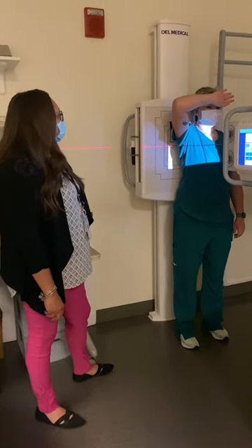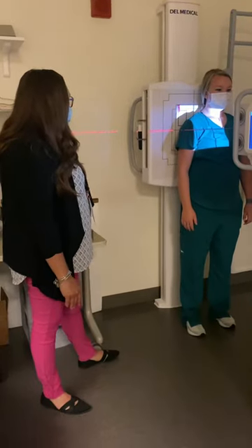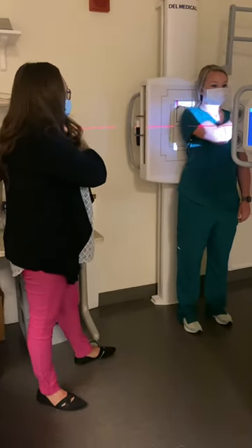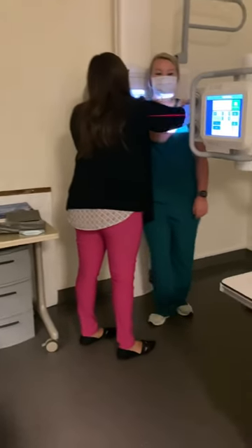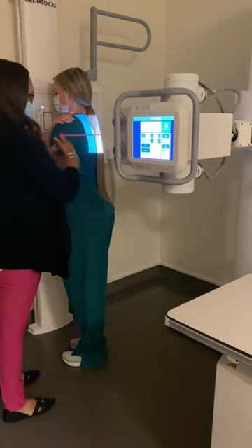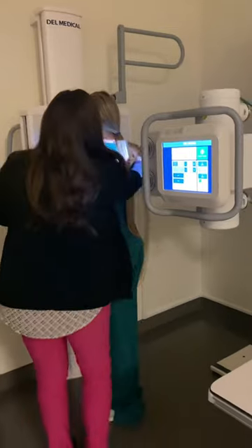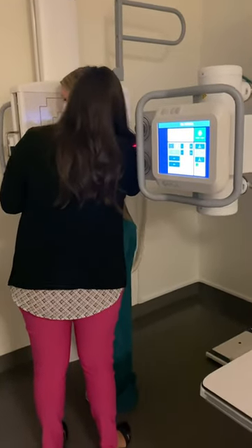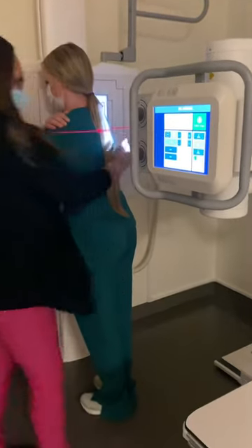After I'm done with that one, I'm going to tell my patient you can lower your arm down. Then what I'm going to have you do is bring your right arm over and touch your left shoulder. I'm going to have my patient turn towards the board, keeping that shoulder in contact with the IR the entire time to help eliminate any confusion. Then I'm going to ensure my patient is rotated 45 degrees, centered over the mid-scapula.